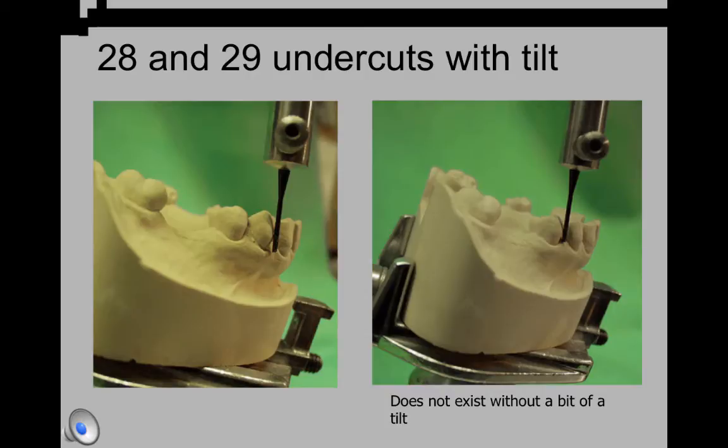But the idea is that you want to have the least amount of tilt on the cast and the least amount of severe modifications of the teeth, and that's the position you want to choose and come up with the positions for your direct retainers. I know that's a lot to think about, but every time you change the tilt of that cast, you have to go back and look at the undercuts on all the other teeth to see what you have changed, as well as the guide planes. But you're trying to find that ultimate best position where you have to modify the teeth the very least.